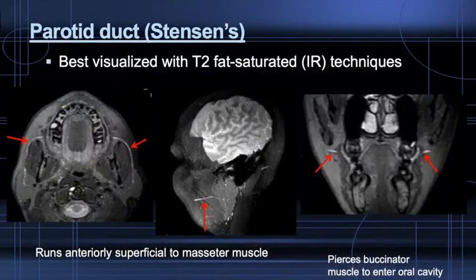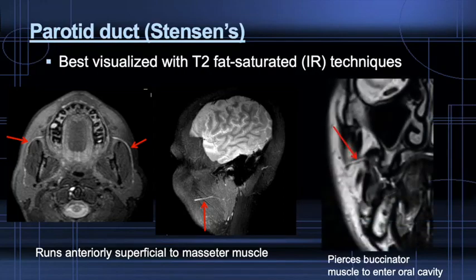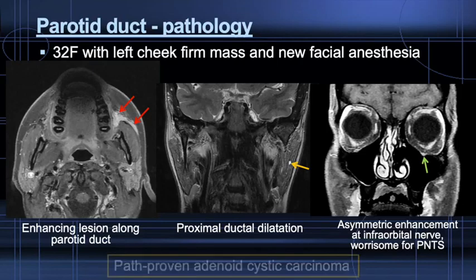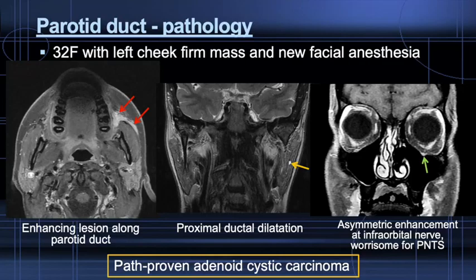The parotid duct exits the anterior superficial parotid lobe and courses within buccal fat, superficial to the masseter muscle. It is best visualized on fat-saturated T2-weighted MR imaging. On thin-section T2 coronal imaging, the duct is shown to pierce the buccinator muscle as it drains into the oral cavity at a papilla along buccal mucosa, usually at the level of the second maxillary molar. A patient referred for a left oral cavity submucosal mass showed enhancement following the parotid duct proximally; biopsy proved this to be adenoid cystic carcinoma, notorious for perineural tumor spread.